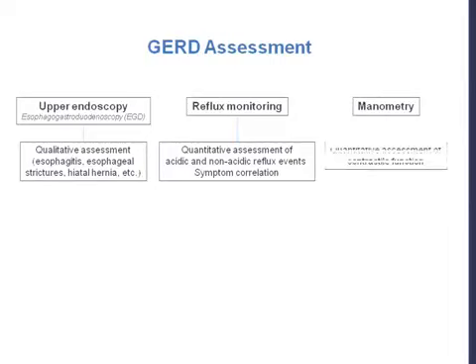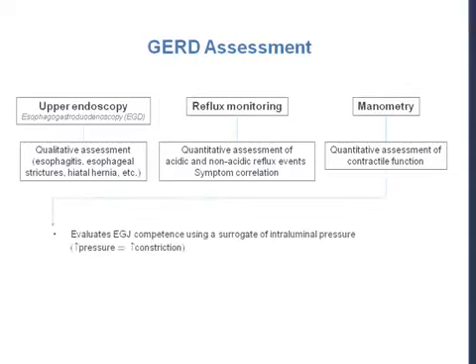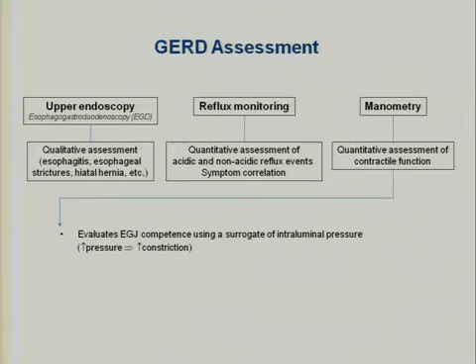Of the musculature, what we have at our disposal is manometry, which allows us to assess the contractile function. When it comes to evaluating with manometry the function of the EGJ, it's something that assesses competence, assuming that intraluminal pressure, or at least the increase in intraluminal pressure, is consistent with increased contraction within the junction itself.